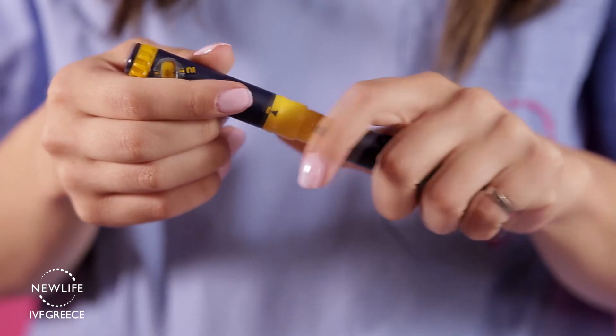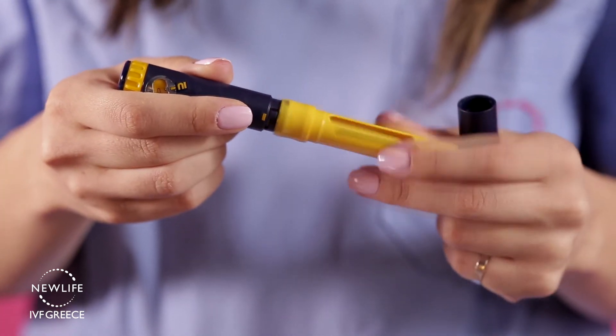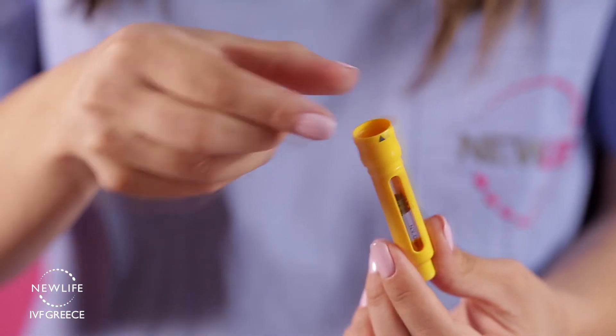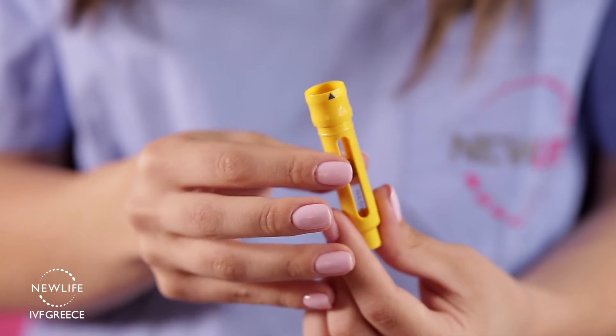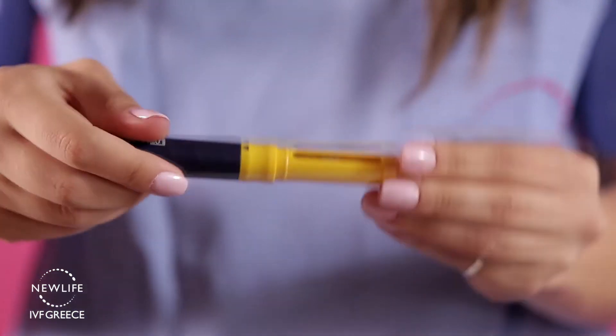Take the cap off the pen and unscrew the body from the cartridge holder. Insert the Puragon medication into the yellow cartridge holder part of the pen, making sure the metal cap goes in first. Next, screw the body onto the cartridge holder and tighten firmly. You now have 900 units of Puragon in your pen.